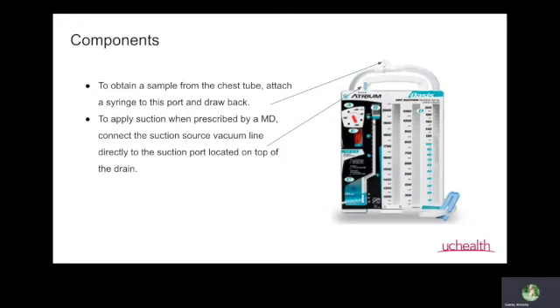If a chest tube is to suction, a patient must ambulate with portable suction. Equipment can be ordered in Epic in order to do this. An RN must accompany a patient during transport if a chest tube is to suction.